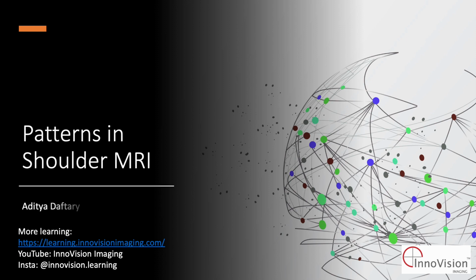Hi everybody, this is the talk on patterns in shoulder MRI. At the outset, I just want to let you know that it is good if you have a basic understanding of shoulder anatomy before you do this talk, but even if you don't, it'll be pretty helpful to you.